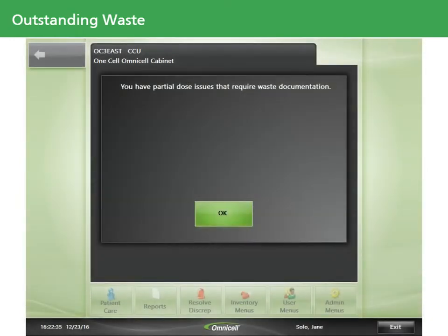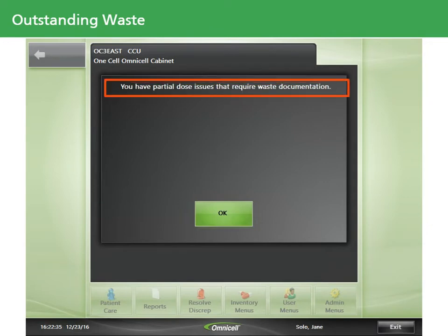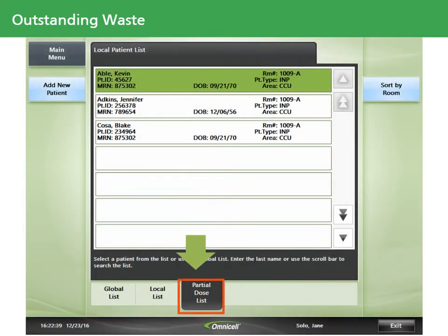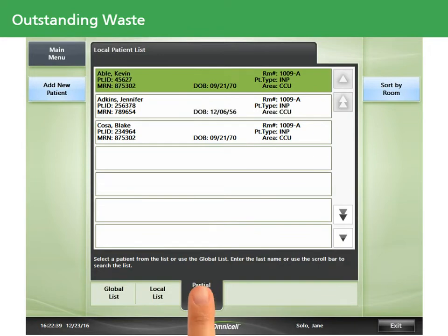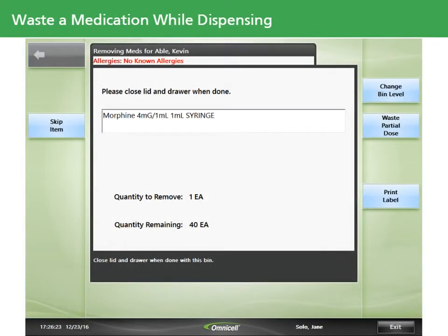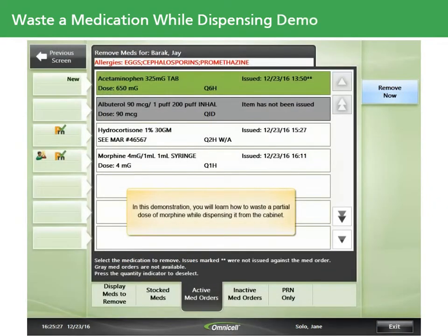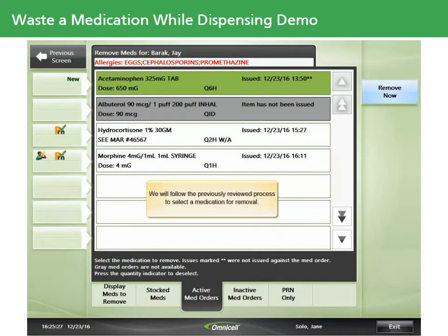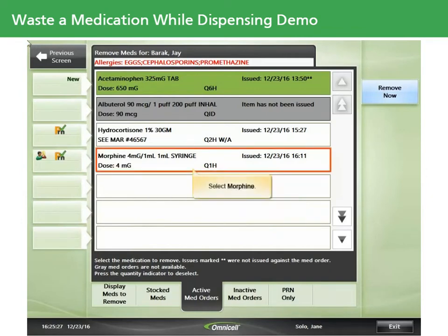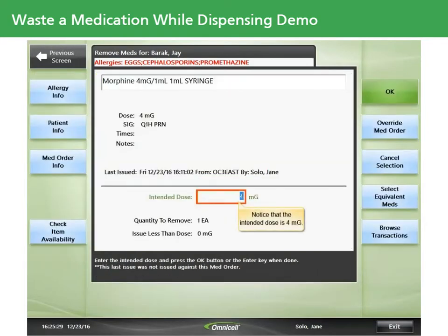When the system detects that you have an outstanding waste for one or more medications, it will prompt you upon login that you have partial dose issues that require waste documentation. You'll then select the partial dose list, which is populated with patient names who have undocumented medication issues, and document the outstanding doses. While dispensing a medication from the OmniCell cabinet, you also have the opportunity to waste a partial dose during the issue of an item. Touch the Waste Partial Dose button to initiate the waste. In this demonstration, you'll learn how to waste a partial dose of morphine while dispensing it from the cabinet.